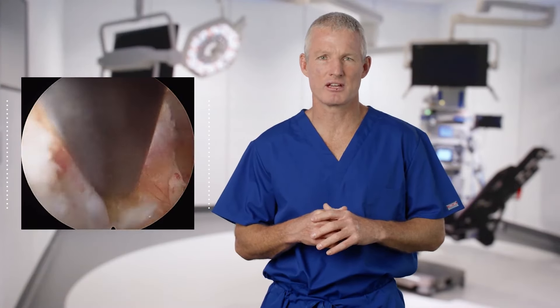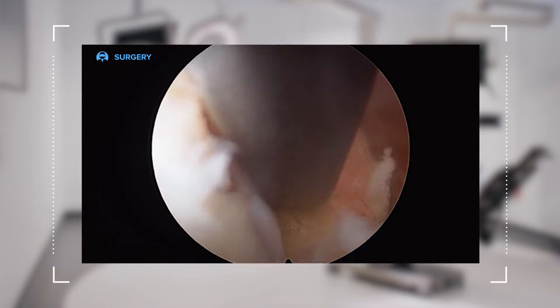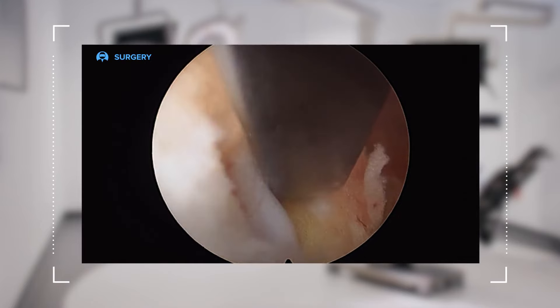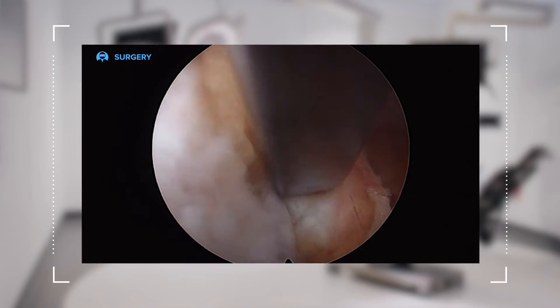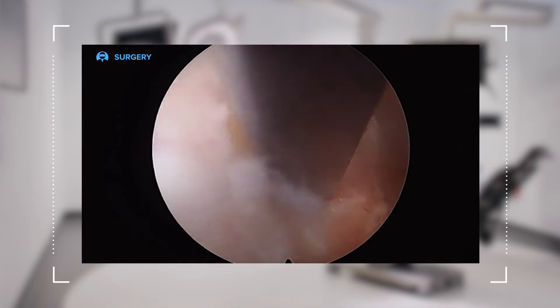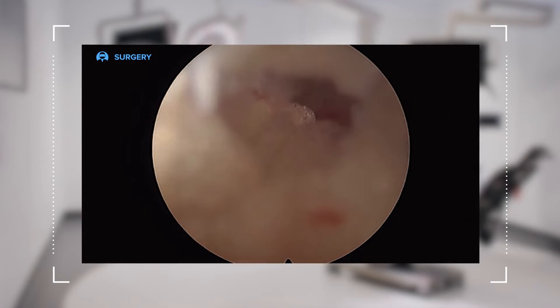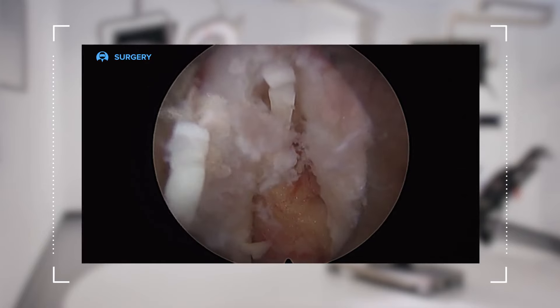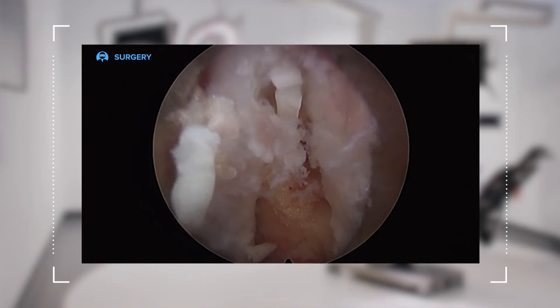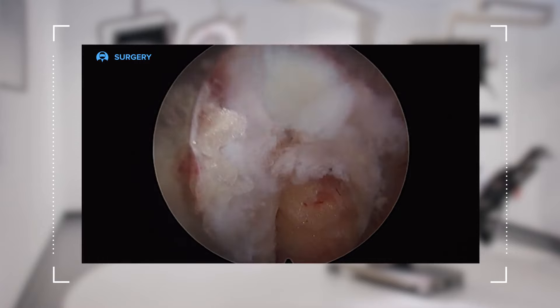At this stage in a posterior endoscopic decompression of the spine for a disc herniation, we've safely traversed through the ligamentum flavum and established ourselves inside the spinal canal. The next goal is to identify the lateral edge of the nerve root, which needs to be retracted safely out of the way in order to expose the disc herniation. I do that by using an endoscopic freer elevator to manipulate the lateral edge of the nerve root, place it under tension, and then wand the cannula towards the patient's midline to release that nerve root up over the disc herniation.